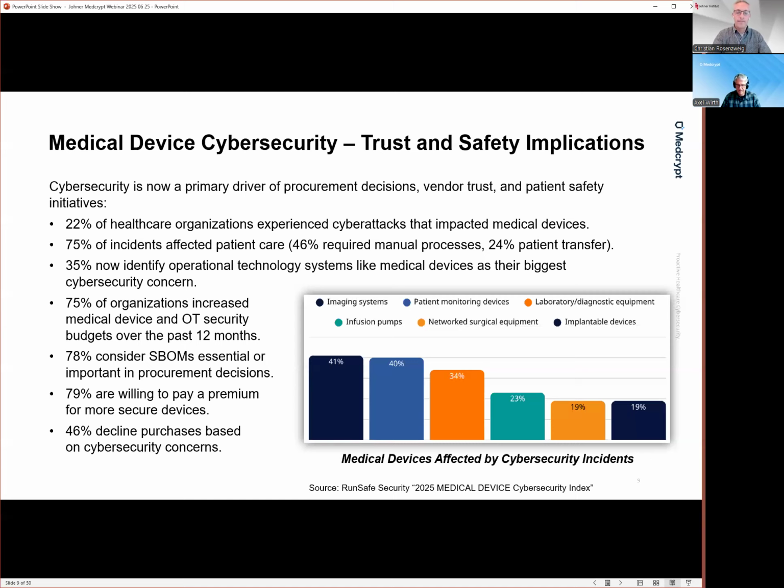And I think the rationale here is looking at the total cost of security. If I buy an insecure device, I will incur cost because I need to spend additional effort to secure the device externally and via the network. And I may incur an additional cost due to business losses should the device get compromised. And clearly it's recognized that paying more for a secure device in the long run saves money for the hospital. And therefore, again, the statement here that almost 80% are willing to pay a higher price for better secure devices.